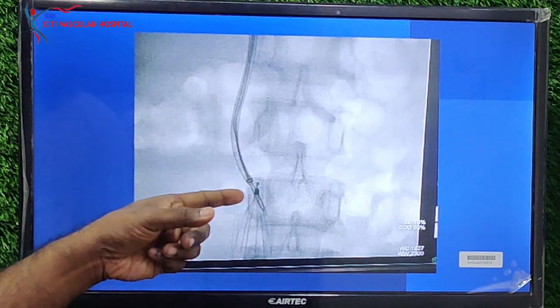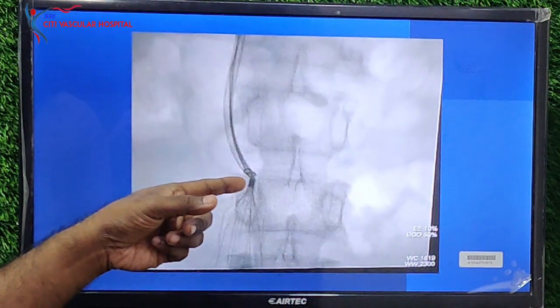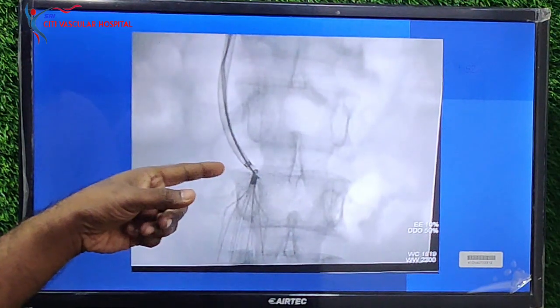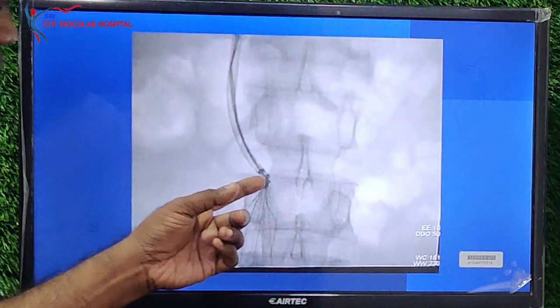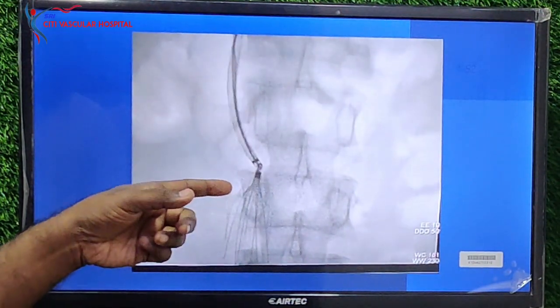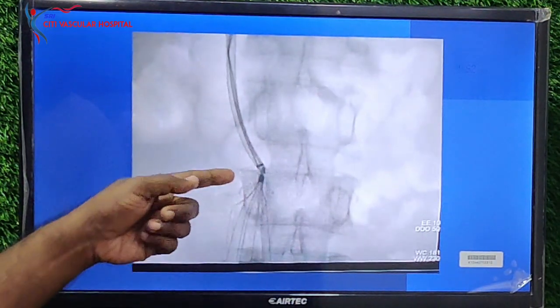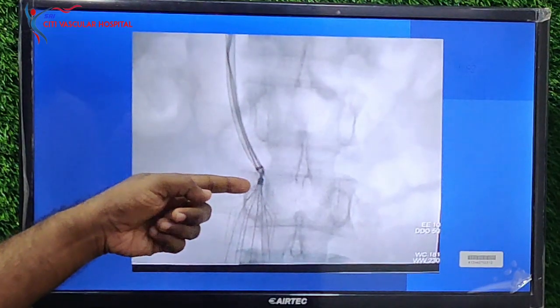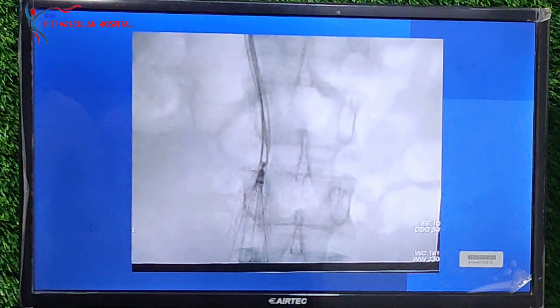There you can see nicely — we are slowly capturing the hook of the IVC filter. Once we are in position, we will try to get that hook into the sheath. Importantly, we never try to pull the snare. We keep the snare steady and advance the sheath over the snare so that the hook gets into the sheath.